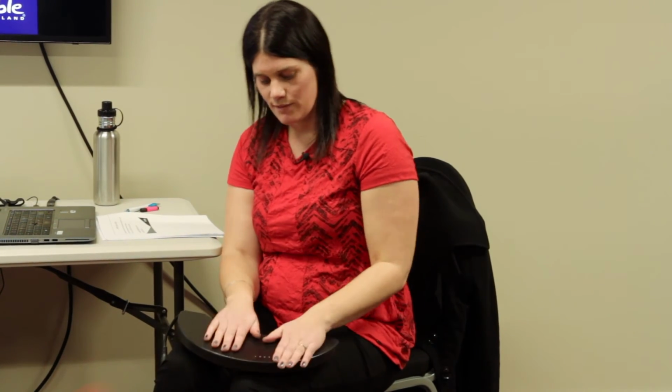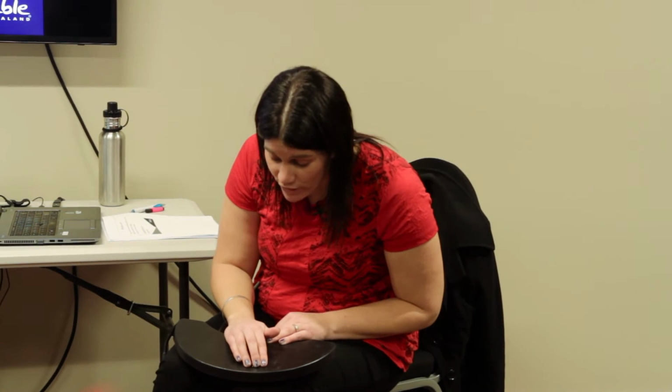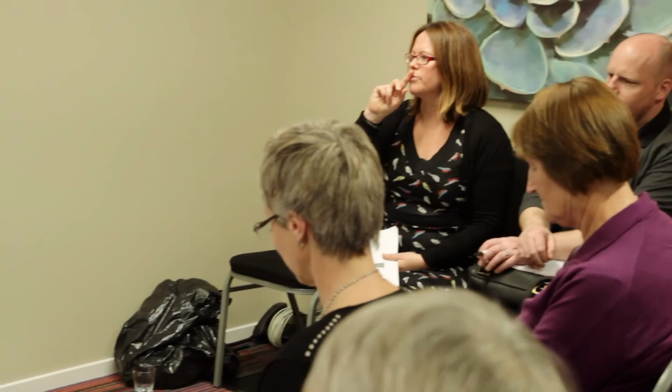I've never used it in a tray format like this, but I can see how a single switch would be really useful. But in saying that, you can drive with a couple of fingers, and all 4 fingers fit. If you've got some little movement, it's potential they could be driving. So I think the one thing to remember with these and with the mini switches, Rachel's talked about you can use it with just the tiniest bit of movement. The most important thing about that tiniest little movement is it needs to be consistent. So they need to have control over what they've got.